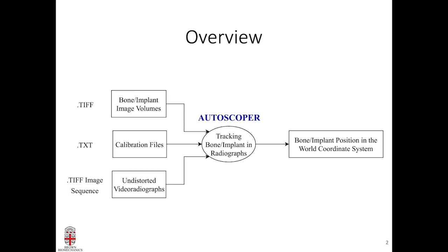Autoscoper takes three types of input. One is the bone or implant image volume — this is a partial CT image. Another input is the calibration files, which define the 3D world view for Autoscoper; they are basically the camera model or x-ray source models. We also need the undistorted video radiographs, since we are doing tracking over them.